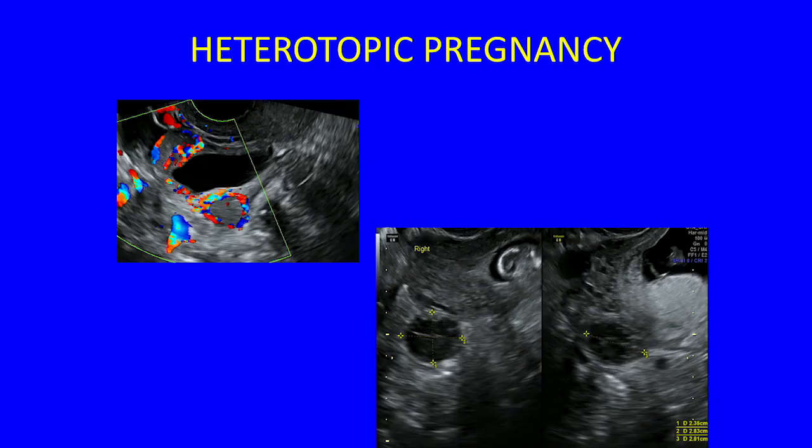And what I could see, this is her ovary. You can see there's a little bit of fluid within the ovary. You can see 1, 2 corpora lutea. Yeah, this is her ovary. Then looking at her uterus, toward the right side, on the same side as her corpora lutea, like any ectopic is often much more likely to be on the same side as the ovary with corpus luteum in it. There was an intrauterine pregnancy, but there's also this lesion just in an almost subserosal position, but it was exactly at the level of the interstitial portion of the fallopian tube, and this was it in the transverse view.